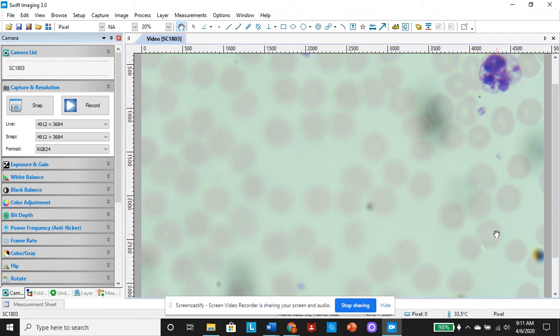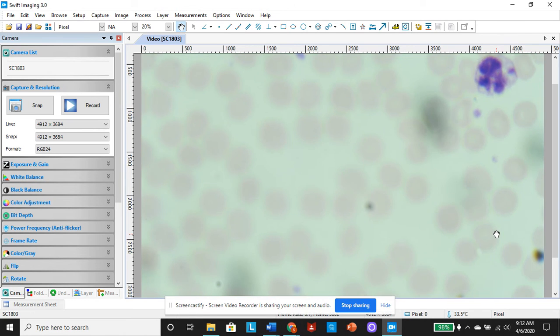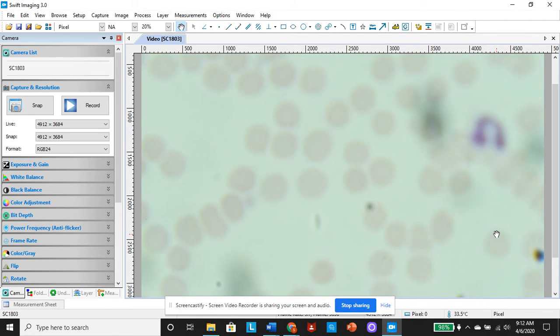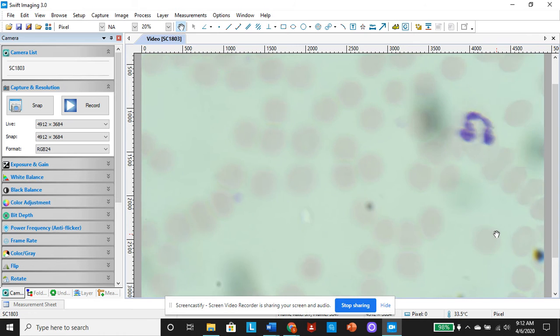Your monocytes are the guys that go out and they're the phagocytic ones. So they're the ones that are eating bacteria and destroying old cells, and you'll even sometimes see them with cells inside them. I've seen monocytes engulfing red blood cells on smears. It's really, really neat. So you'll see all sorts of cool stuff like that. Sometimes you'll see bacteria inside of the monocytes. You'll see them where they've started to ingest them.